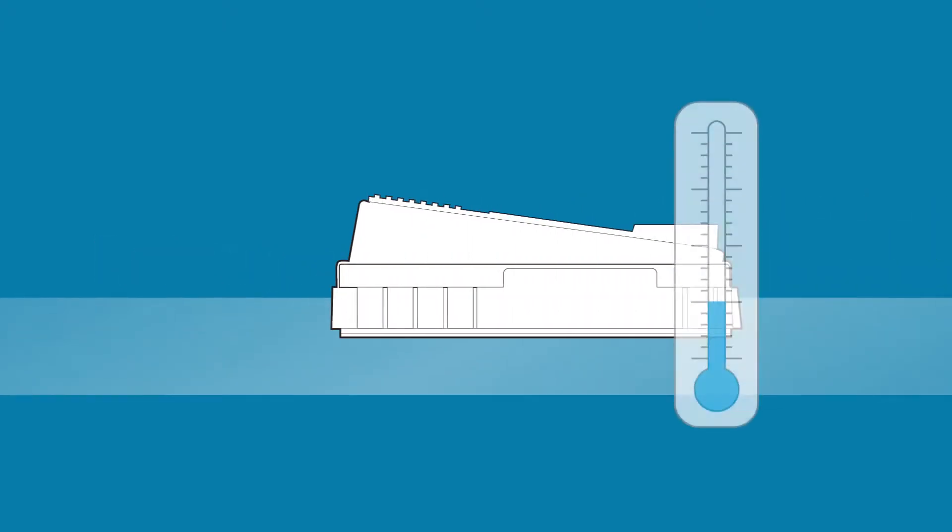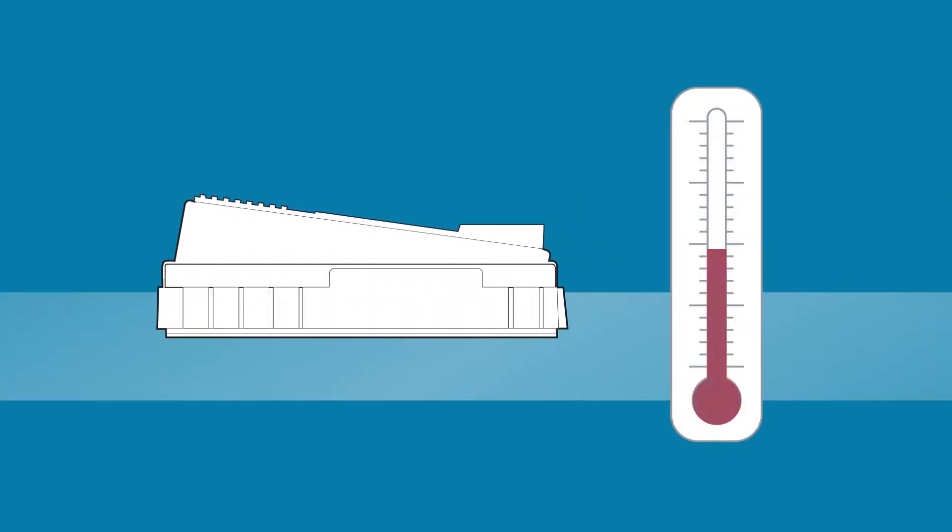Make sure the test is at room temperature. For convenience, remove tests from the refrigerator at the beginning of the day.